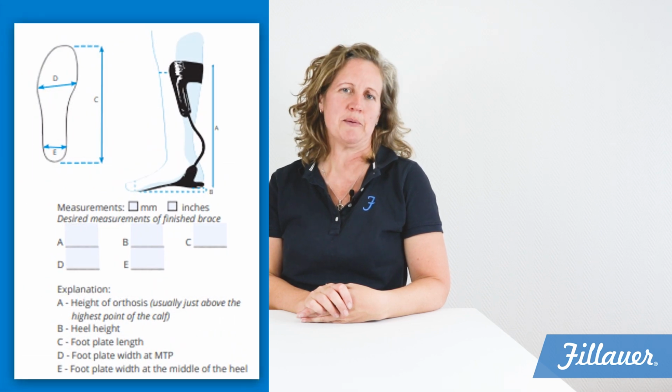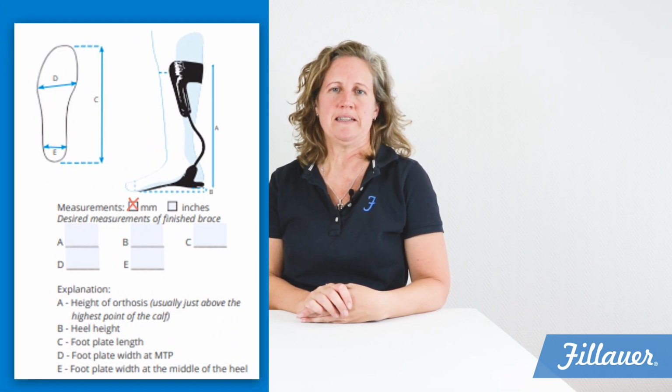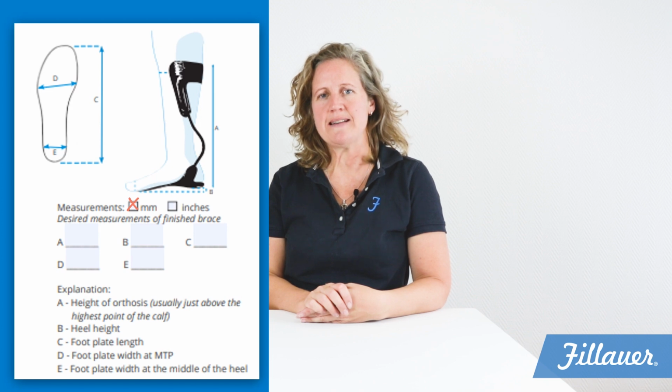The first thing you need to do is go into our website and download our order form. On this one, there are some measurements you need to fill in. You can either do them in millimeters or you can do them in inches. It's all up to you, but you need to stay consistent. What I'm going to be doing today is millimeters.